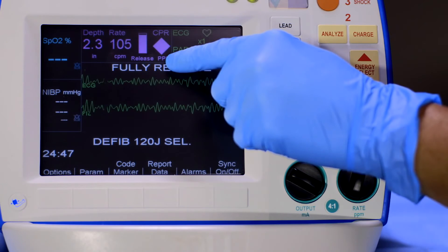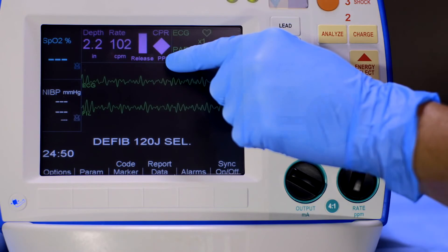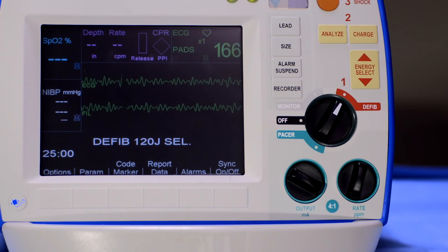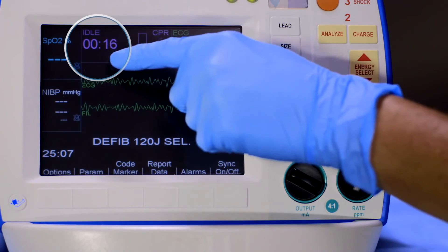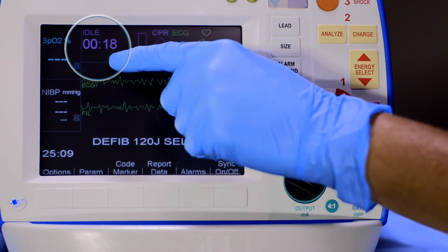When compressions have been interrupted for an extended period of time, idle time is displayed in minutes and seconds. This is a visual reminder to help minimize pause time.